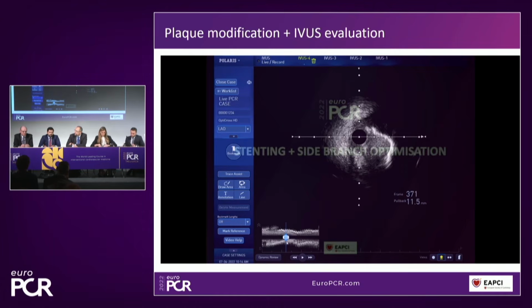How about in-stent stenosis? Exactly for that reason, about the slipping, the pipping, I like it in this. In-stent restenosis, it will always slip, because of the nature of neo-intima, assuming this is in-stent restenosis, not a badly deployed stent. If it's neo-intima, then a normal balloon will almost always slip. And the only way you fix it is to use a balloon that's too long on either end, and therefore you then end up putting a much longer stent in. So a cutting balloon is a good idea for in-stent restenosis.